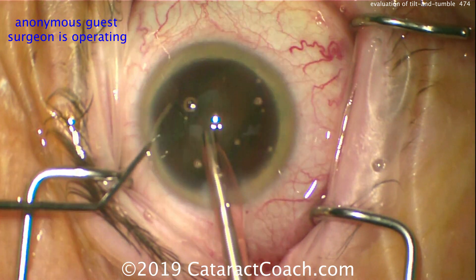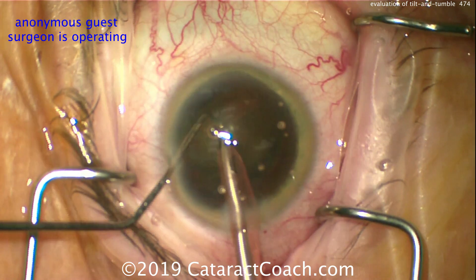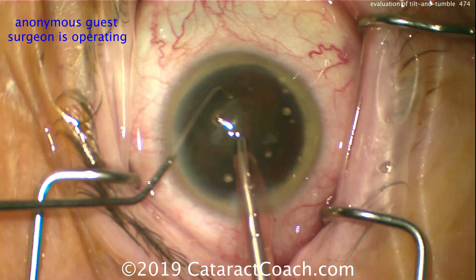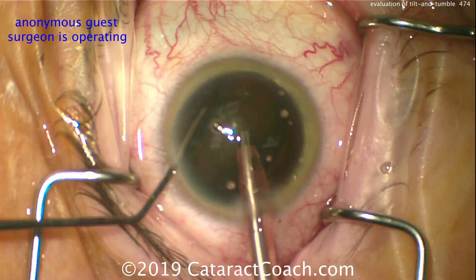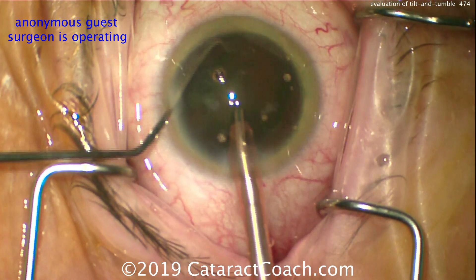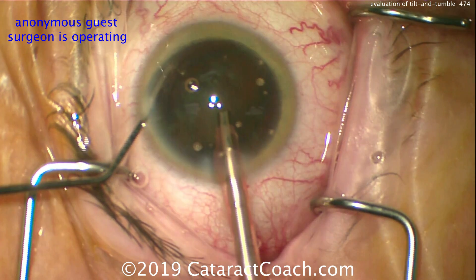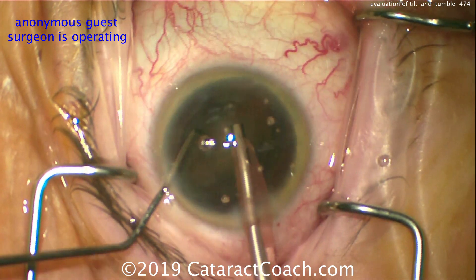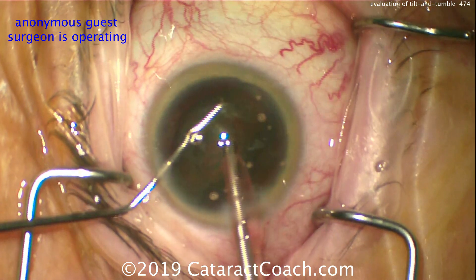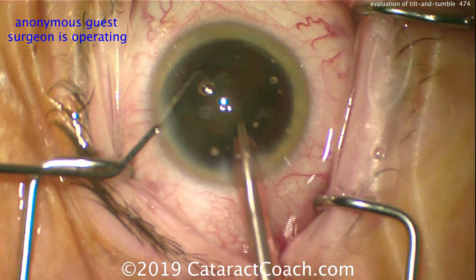The reason why the nucleus isn't tumbling in so easily is partly the settings — you need a higher flow rate here. The very slow leakage out of the incision tells us it's relatively low flow. You also want to adjust the tip of the FACO probe so you're keeping it near the lens material. This is a peristaltic pump — if you're not occluding the FACO tip, you won't achieve high vacuum. The name of the game in tilt and tumble is achieving high vacuum, and that means occlusion. You've got to keep the FACO tip occluded.